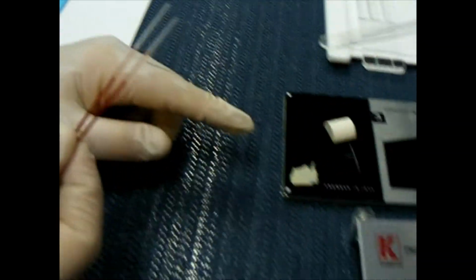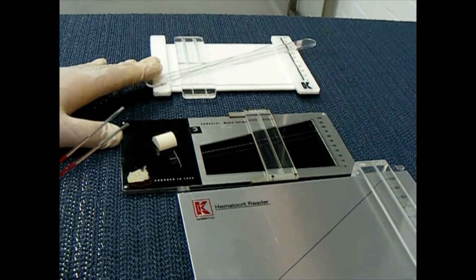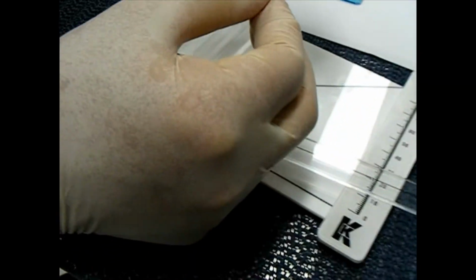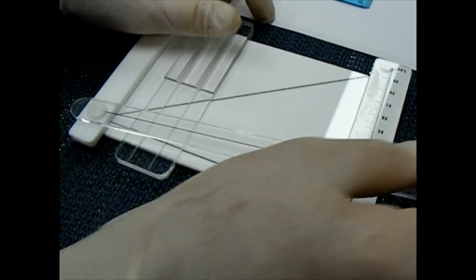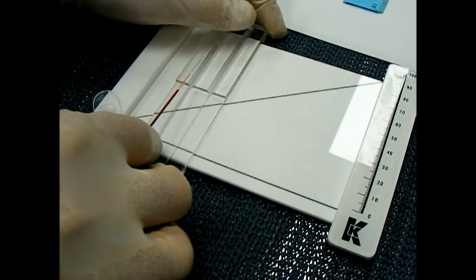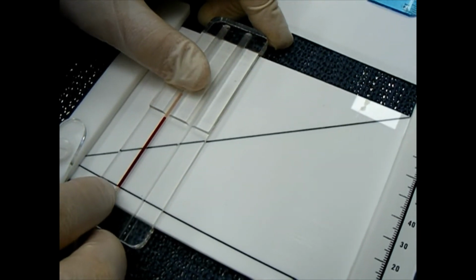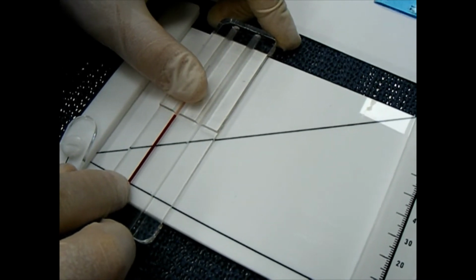Now let's have a look at the readers. There's a lot of different types of readers. You should become familiar with the ones in your practice, and I'll show you how to use these ones here. Now there's usually 2 steps in the process to reading a PCV with a reader. So the first one is to get this arm here out of the way, because you don't use that for the first step. The first step is to put the tube into this little rack, and like when you're measuring, you put the black line on the bottom of the red blood cells like that.